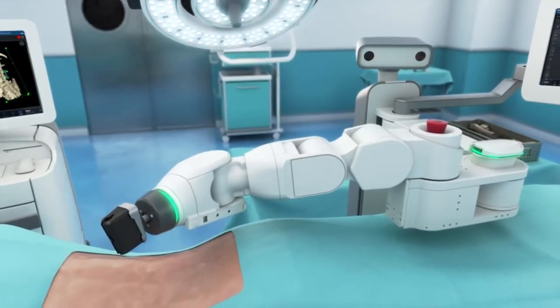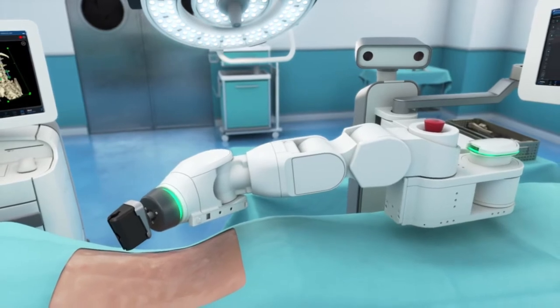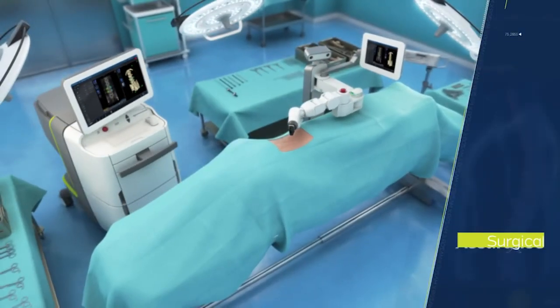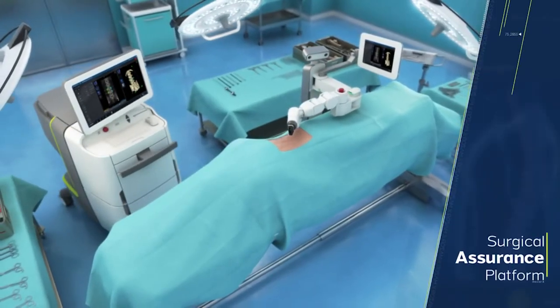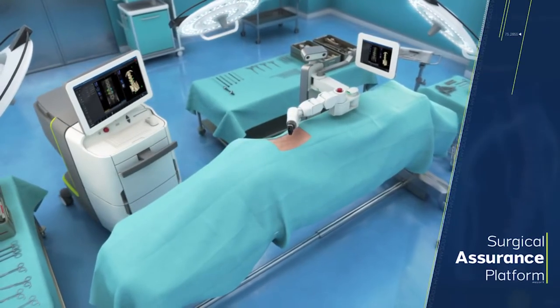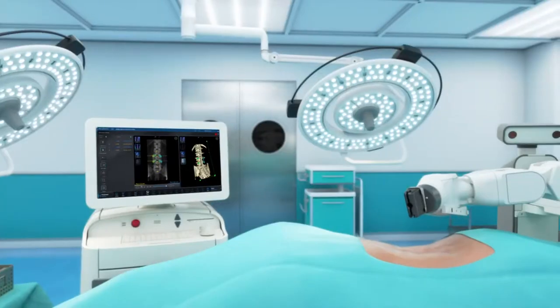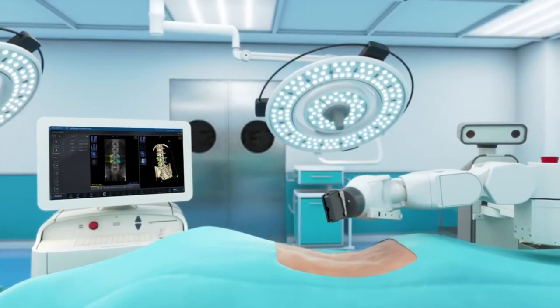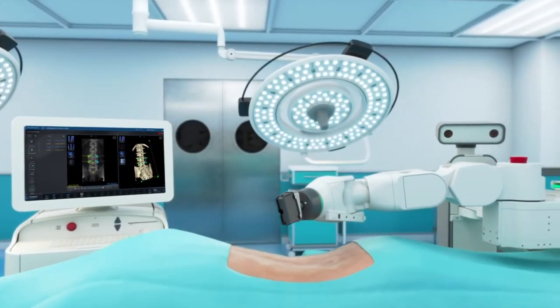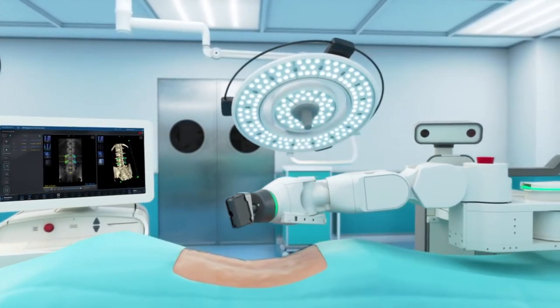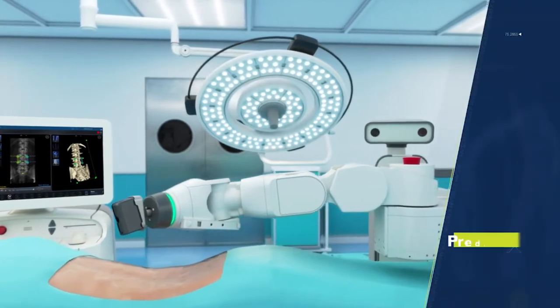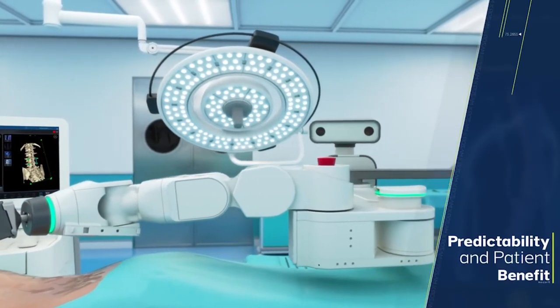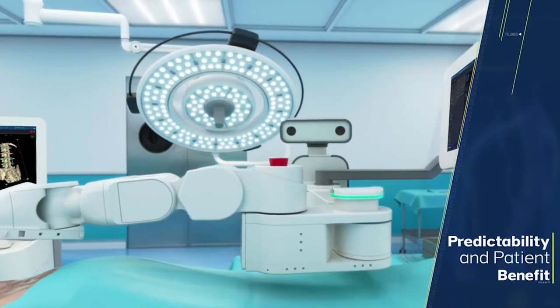Expand possibilities with the MZORAC system, a surgical assurance platform for spine surgery, integrating advanced application analytical tools, guidance and imaging technologies to maximize procedure predictability and patient benefit.